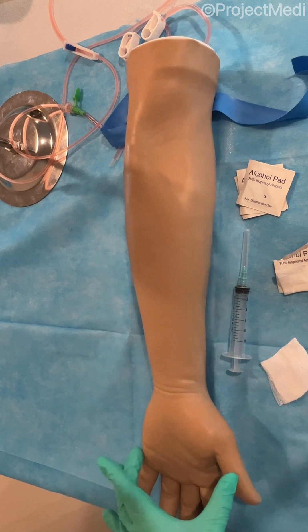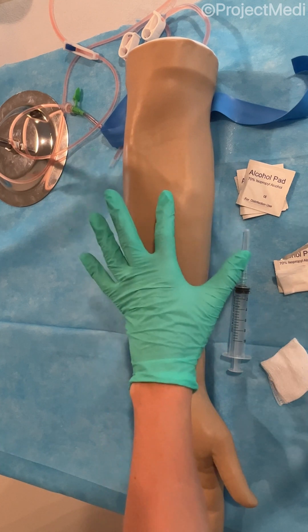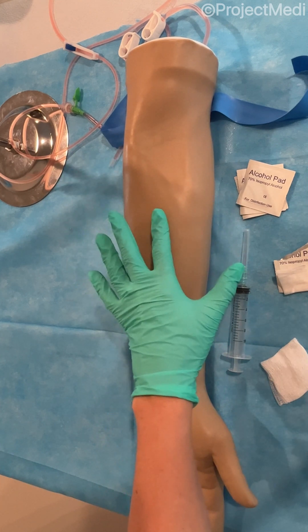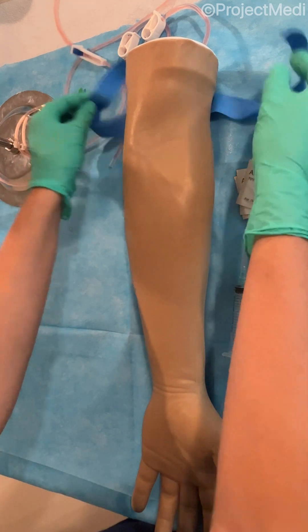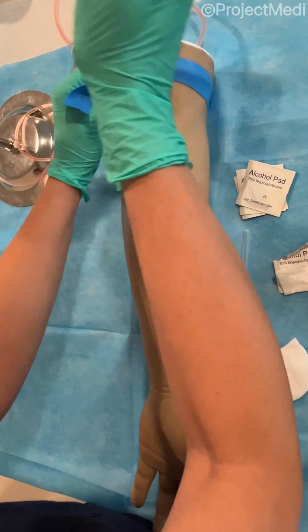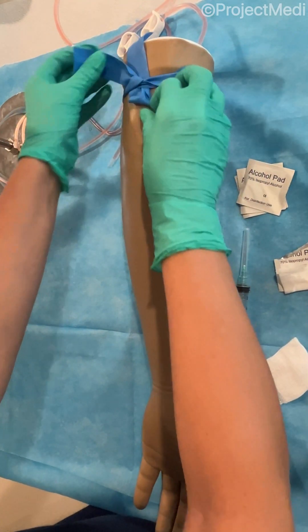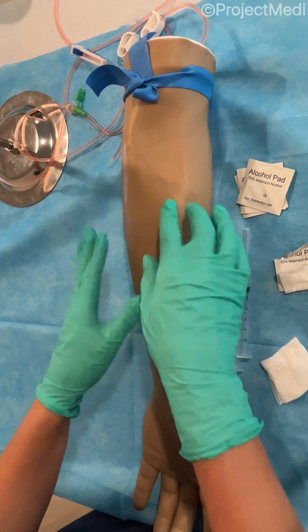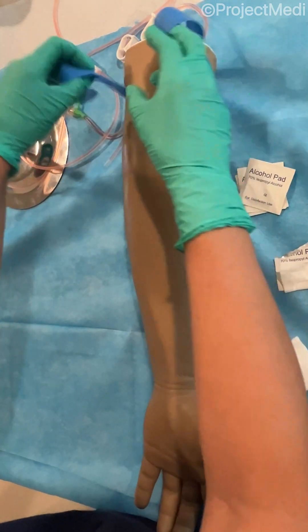Set up the training arm with the palm facing up. Veins in the antecubital fossa are often ideal for venipuncture and we do tend to start here. Next, we're going to tie our tourniquet two to three inches above the venipuncture site. When tying a tourniquet, quick release is the most important, so you want to do the bottom loop through so you can pull for a quick release once you're done collecting the specimen.